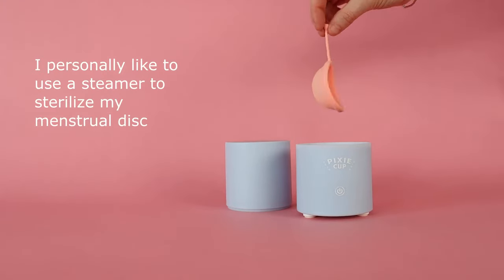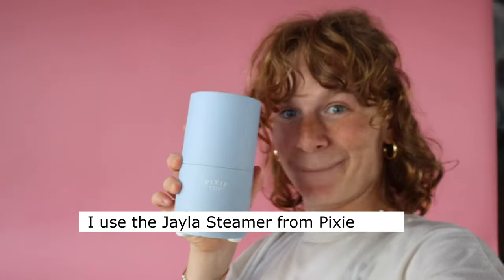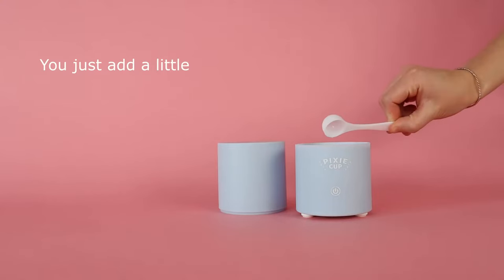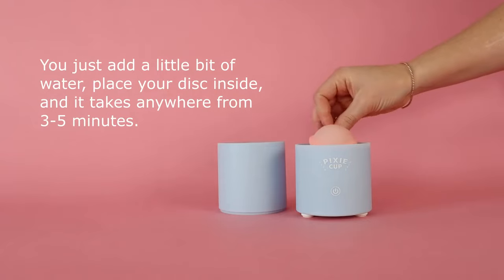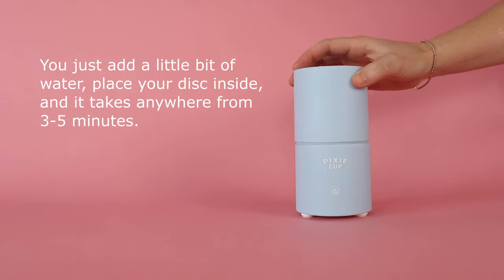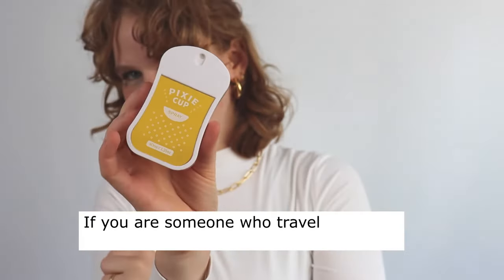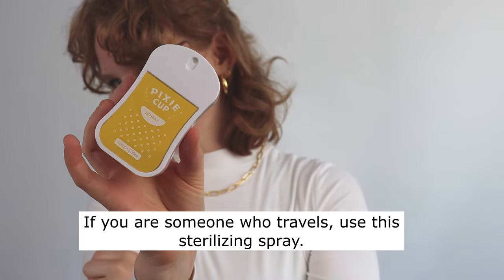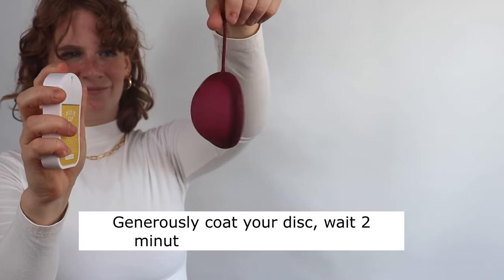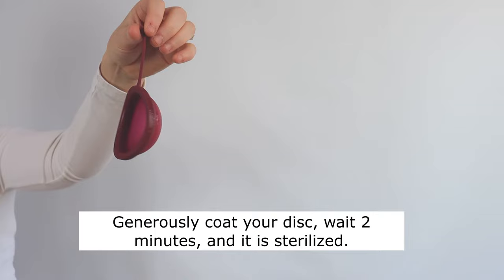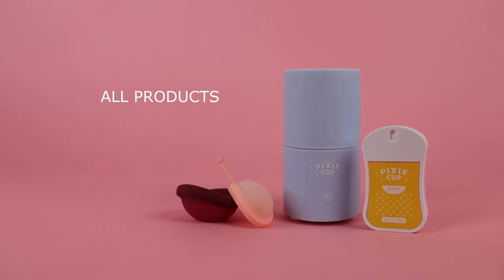I personally like to use a steamer to sterilize my menstrual disc. I use the Jayla steamer from Pixie Cup. You just add a little bit of water, place your disc inside and it takes anywhere from three to five minutes. If you are someone who travels, use this sterilizing spray. You just generously coat your disc, wait two minutes, and it's sterilized. All the products I just mentioned I do have them linked below so you can check them out there.